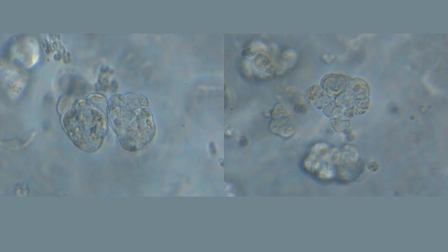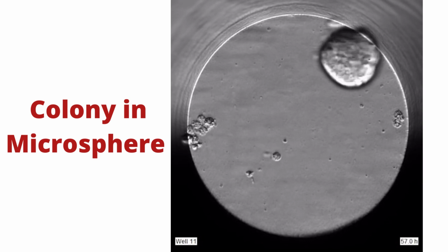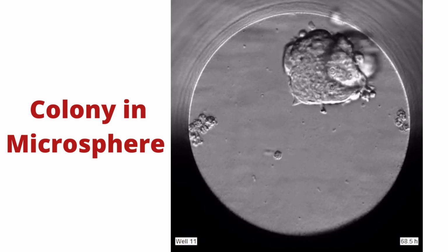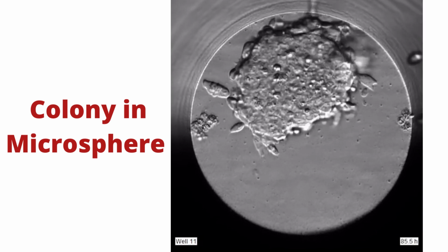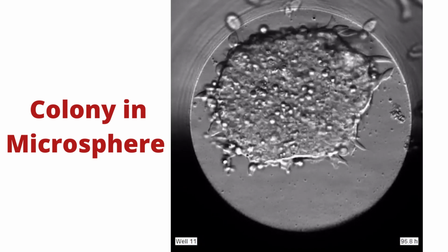Because of the translucent nature of the spheres, pictures were able to be captured of the cell colonies after spherification. This aspect of our novel process could be vital in wider applications. In order to allow 24/7 visualization under time-lapse monitoring, we resized the microsphere to approximately 200 micrometers using a single embryoscope slide well as a mold. This video shows the colony as it progressively expands and grows exponentially at a rate comparable to a two-dimensional culture system.